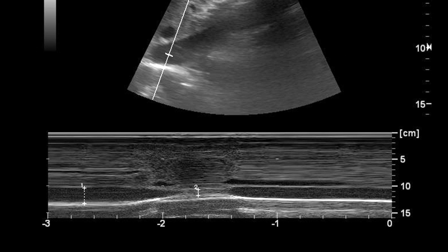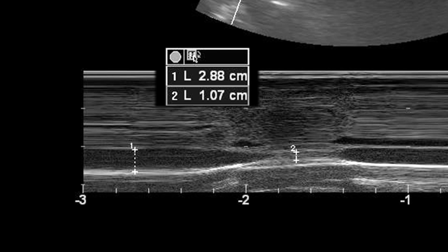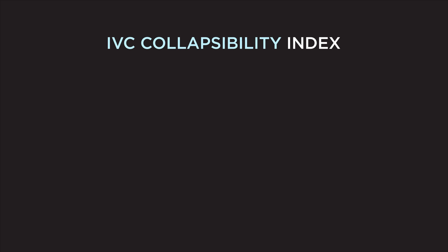The M-mode tracing shows the variability of the IVC diameter with respiration over time. Measure the maximal IVC diameter and minimal IVC diameter represented on the M-mode tracing. Here we see normal variability of the IVC with respiration. It may be necessary to ask the patient to sniff to record the minimal IVC diameter. Once the measurements have been obtained, the IVC collapsibility index can be determined.